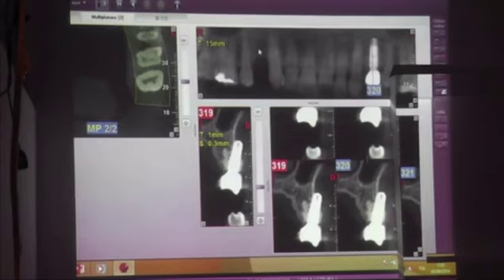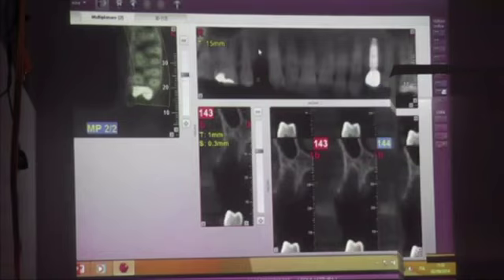He told me, I removed the root 1 month, I put the implant. I told him, okay, but it's very difficult. You have results. Why? Check. Very big. After 2 months, you have the same. It's a big defect. There is some problem. It's very important you maintain this inclination in order to touch the basal bone and have regeneration. If you put the implant in this side, you lose the implant.